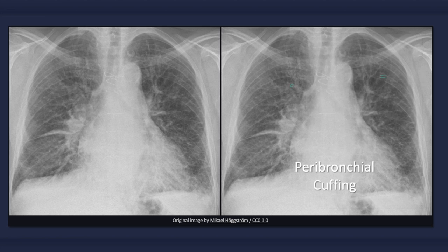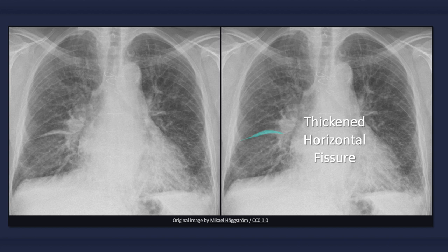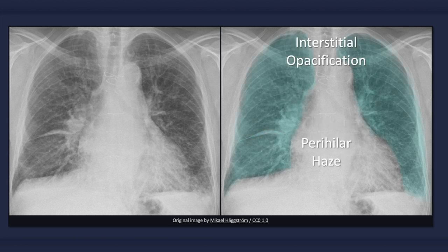Peribronchial cuffing is another discrete finding which occurs due to edema of the bronchial wall. When viewed head-on, it appears as a donut or ring; when viewed tangentially from the side, it appears as two parallel lines resembling tram tracks. Note that peribronchial cuffing can occur in other conditions as well, such as chronic bronchitis. Also evident in this image is a thickened minor, or horizontal, fissure — a finding easier to detect on a lateral radiograph. Collectively, interstitial edema results in widespread blurring of lung markings, with a hazy appearance of the lung fields and hilum bilaterally.